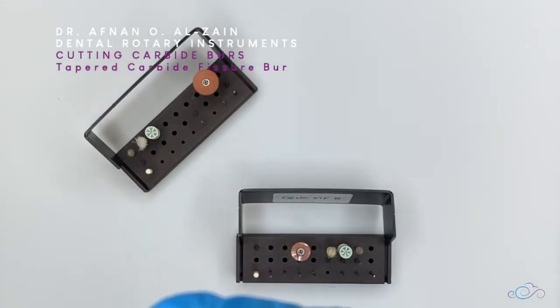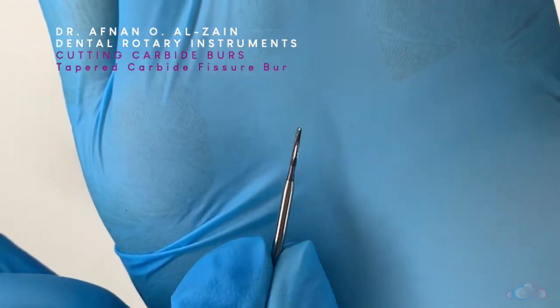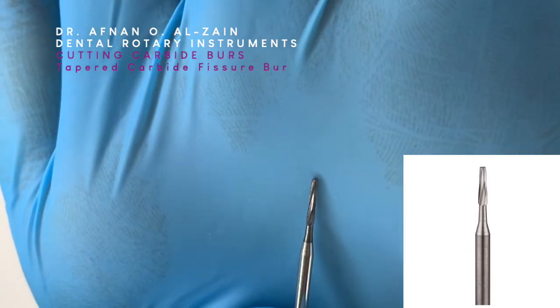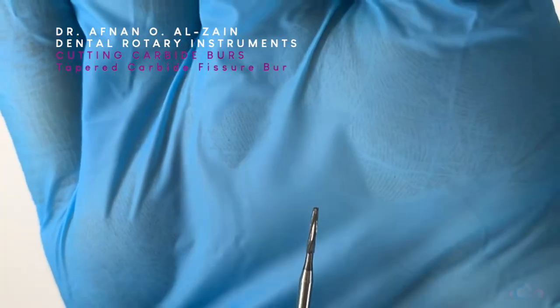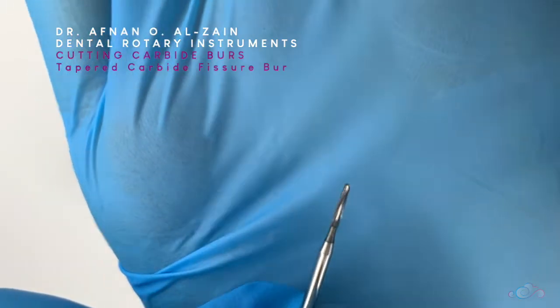The following burr is the tapered carbide fissure burr. It is not cylindrical in shape — it is tapered. So there is a difference between this burr and the straight fissure burr: this one is more tapered. It comes in different lengths, and this is the long one, but it can be available in different lengths.